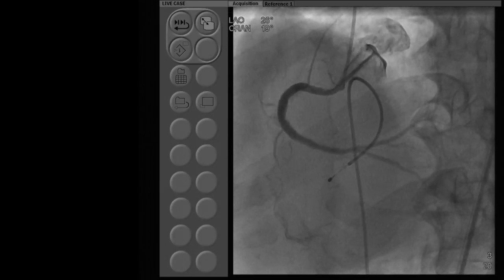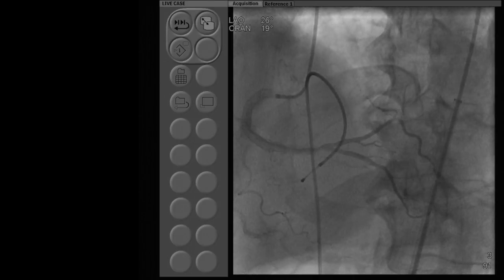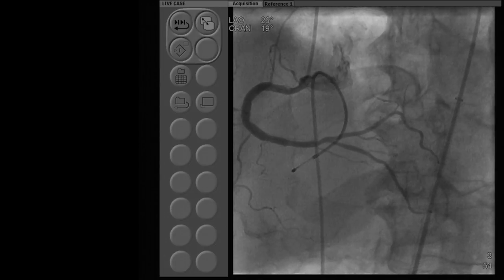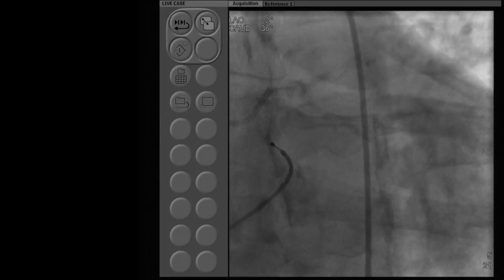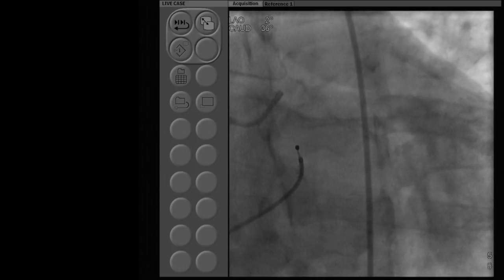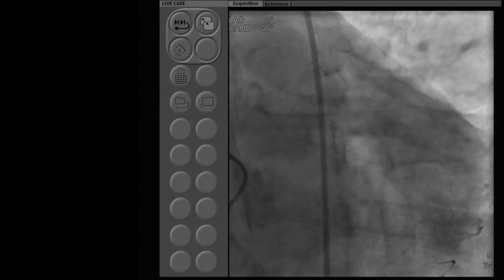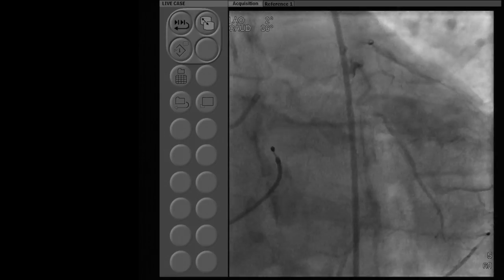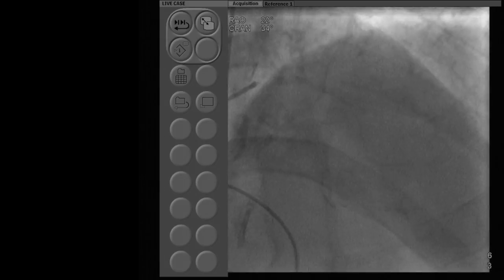This is the right coronary artery with the rota, and after rota we did a cutting balloon followed by stenting and then high pressure balloon. So it's a 3.75. Excellent results of the Promus Premier, and this is your left main, and look at the calcium. You see we didn't inject immediately. Lots of calcium, an eccentric distal left main lesion extending into mostly ostial circ, but definitely extending into the LAD also. Circ itself after that is okay, and this is the LAD.